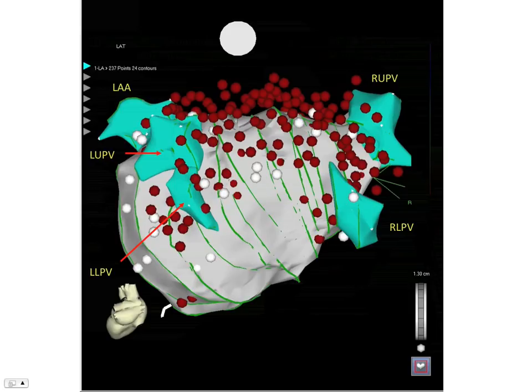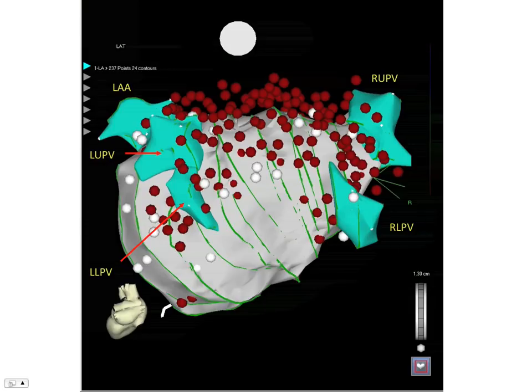Unfortunately, we found that although the contours are acquired in real time and likely represent the true, unperturbed anatomy of the left atrium, once ablation lesions were delivered, a number of times the ablation lesions were beyond the contours, particularly along the roof and the anterior wall, likely representing distortion from pressing against the wall of the left atrium with a relatively stiff catheter.